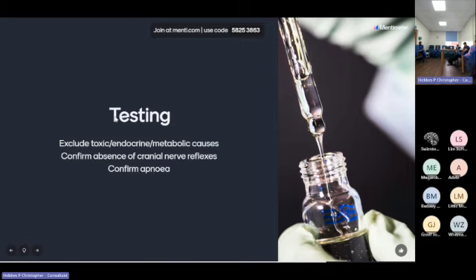So I said right back at the beginning that death by neurological criteria was the irreversible loss of capacity for consciousness along with irreversible apnea. So you confirm that somebody doesn't have the ability to breathe. Essentially we do that by taking a patient off the ventilator. You have to be quite careful because if our patients are on CPAP ASB, the ventilator will detect if they're trying to take a breath and will do some more ventilation for you. If you've got a young fit person who has a big sympathetic response because their brain's being squished, the ventilator will sometimes pick up their cardiac oscillations and, if they were on CPAP ASB, think they're breathing and try to breathe for them.